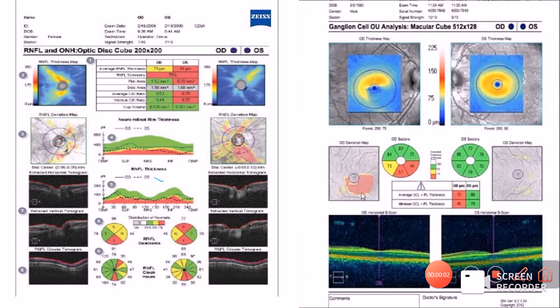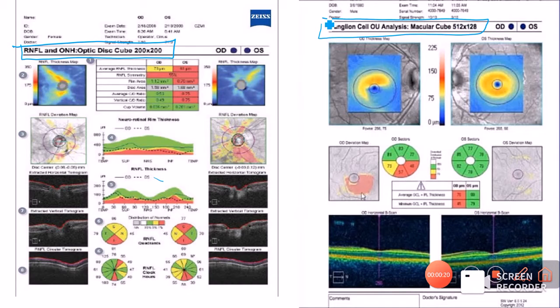Now after we have a basic understanding of the three testing protocols or the three types of analysis of OCT in glaucoma, these are the types of scans that we actually get. The first is the RNFL or the optic nerve head analysis protocol and the second is the macular cube or the macular protocol. Now let us see what are the components of the scan and how to read the scan very easily.